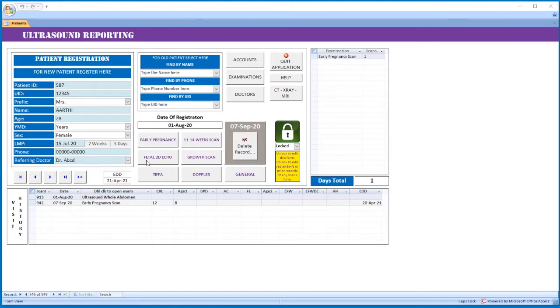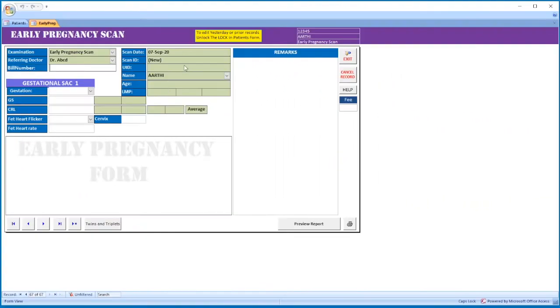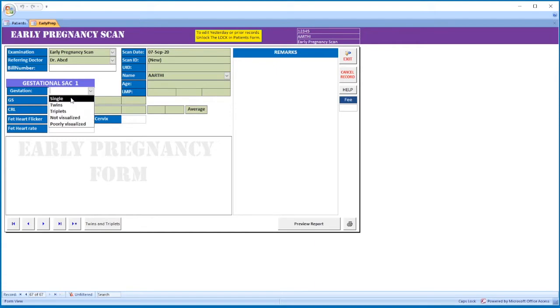If it is an early pregnancy, click here. The patient details are automatically copied here. Select single, twins, triplets, or sac not visualized or poorly visualized.